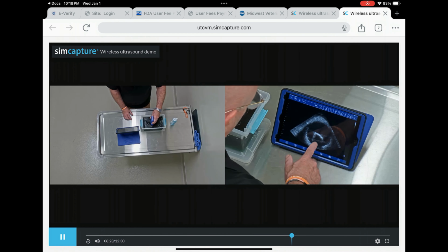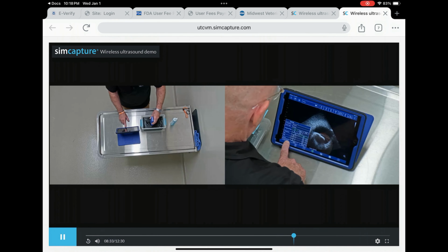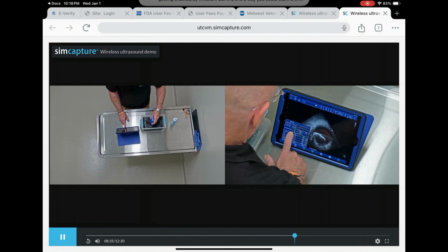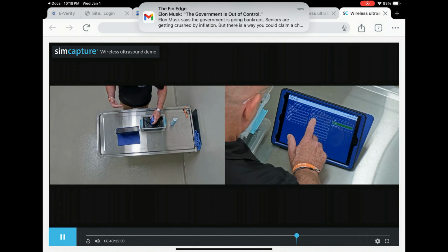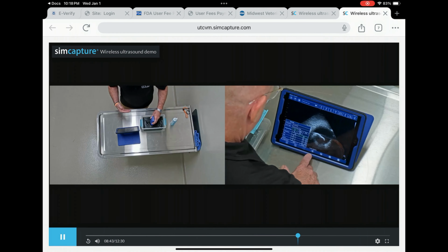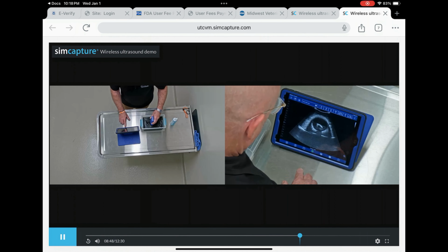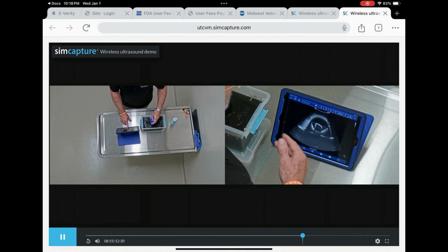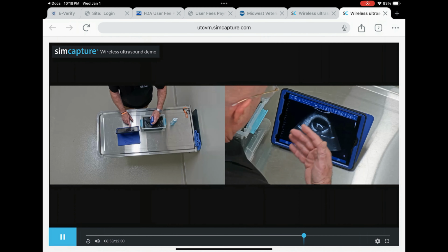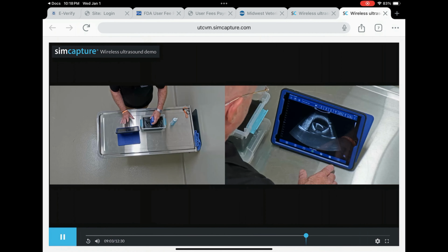and we're still imaging. Saving images is simple. We simply touch the 2 save buttons on the screen. We continue to save multiple images at one time. This allows the user, whether it's student or faculty, to get in and out of the animal's room or location as quickly as possible. Again, I've already demonstrated that even though we're saving in real time, we're grabbing screenshots as we scan. The idea is that even though we haven't analyzed any of them, we can still go back to the patient reel where all of our exams are saved, and we're able to inspect and measure here inside the image reel.